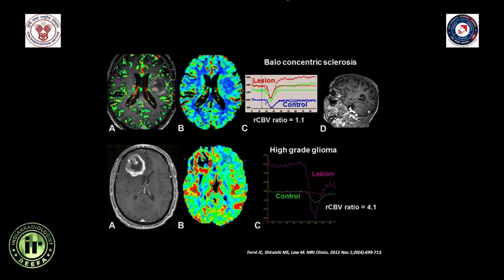Another example from literature shows a lesion with irregular peripheral enhancement that is hypoperfused on perfusion-weighted imaging — implying either a non-tumorous pathology or a low-grade neoplasm. This was a demyelinating lesion (Balo's concentric type of multiple sclerosis). In contrast, a heterogeneously enhancing lesion in the right frontal lobe showing areas of hyperperfusion with rCBV of 4.1 was a glioblastoma.